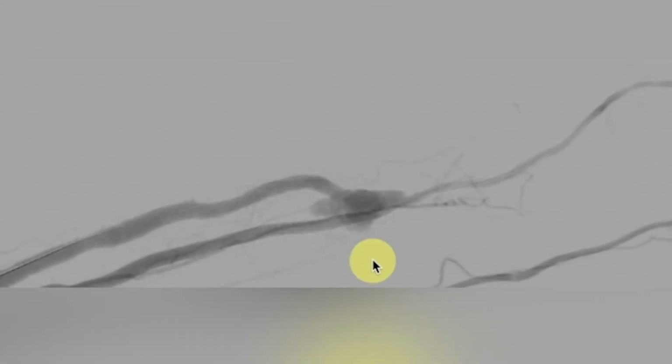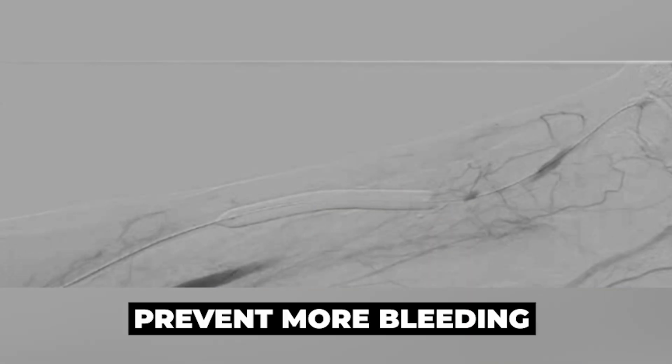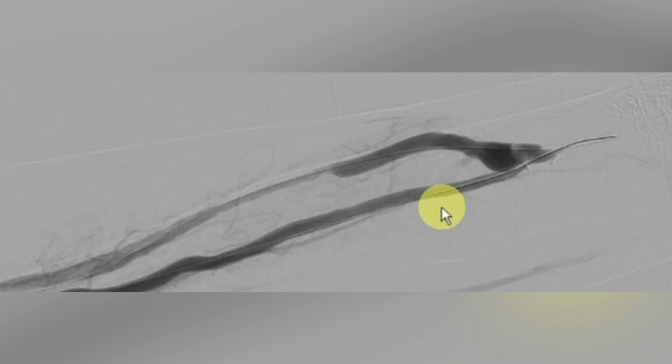The other issue is I was able to get a wire here, but because of the way the arterial anastomosis was done, it was very hard to get a wire going proximally into the radial artery. I couldn't just put a stent across this area, as it would occlude the inflow of the artery. So initially, I put a balloon here to occlude the flow and prevent more bleeding. After ballooning, it was improved, but you can still see some bleeding here that didn't improve.